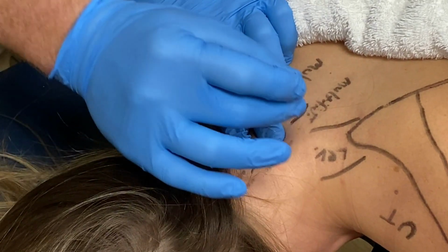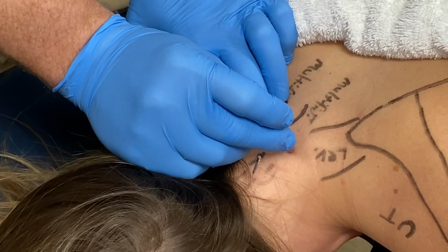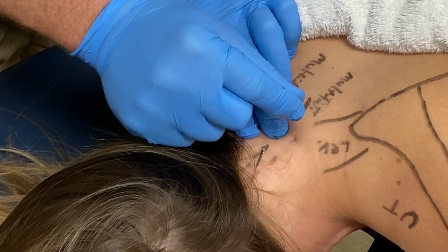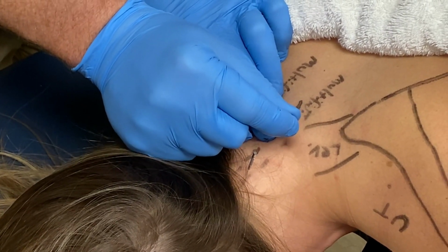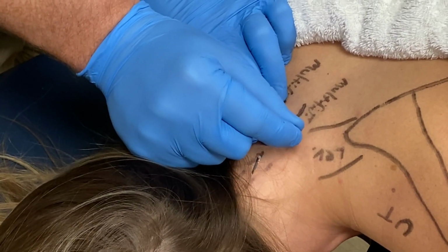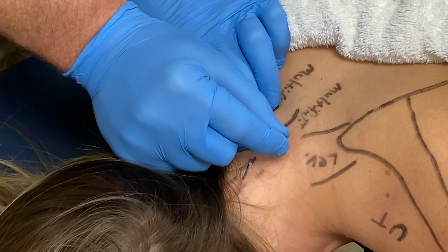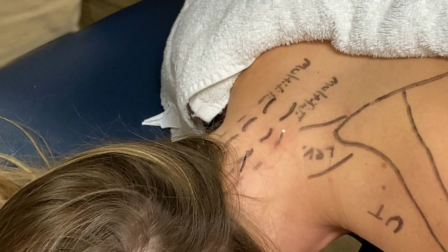Come down to a little bit lower segment. So again, fingers on the edge of the spinous process, little tap. This is vertical. Here's my slightly medial. A little grosser tissue there. You okay? Mm-hmm. There's your lamina right there too.